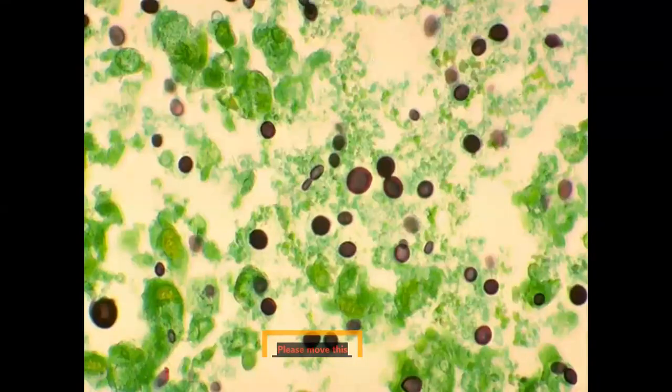This is again Cryptococcus neoformans, but this is a silver staining. Silver staining, I told you in the last lecture that this is a special stain for fungus. Silver stain is also called GMS, that is Gomori methenamine silver stain. The fungus is going to turn black. Any type of fungus is going to turn black, and the background is going to stay green. So this is one of the confirmatory tests that the fungus is present. Whether it is a hyphal fungus or a budding fungus or a dimorphic, any type of fungus is going to turn black with silver stain.